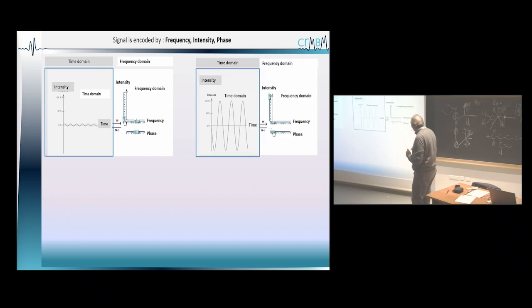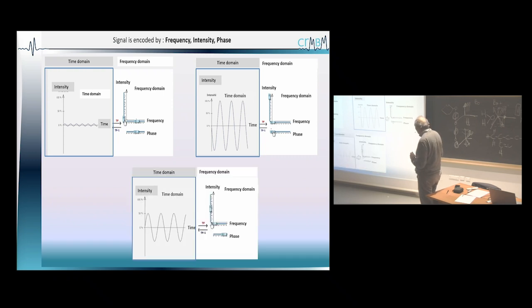If you change the intensity, you can see that you are going to change the overall signal coming from all the voxels in here. And you can also play with the phase, and if you change the phase, thanks to the gradient, then immediately in the time domain, you're going to have some changes in the oscillation in here. So in here, I've also changed the phase. And if you change the phase, instead of going this way, you're going this way. So each time you change something, you need to understand that these changes are related to the gradients you are using during the MRI module.